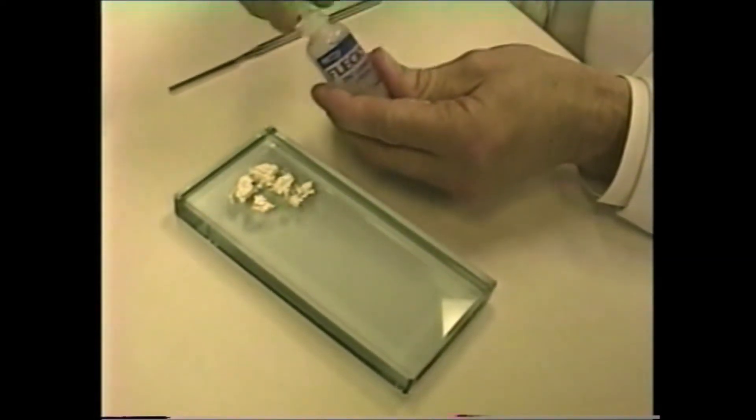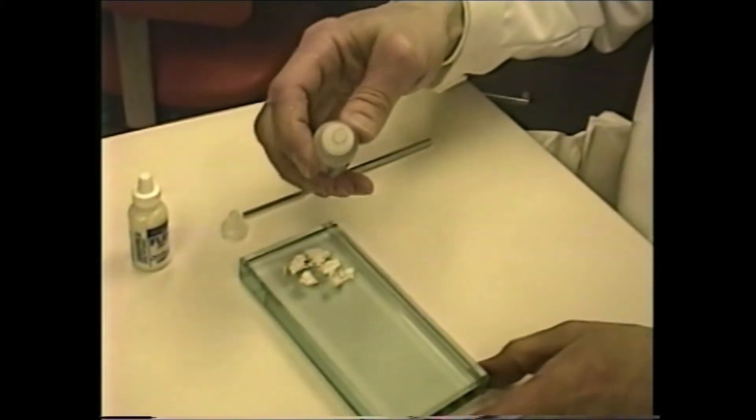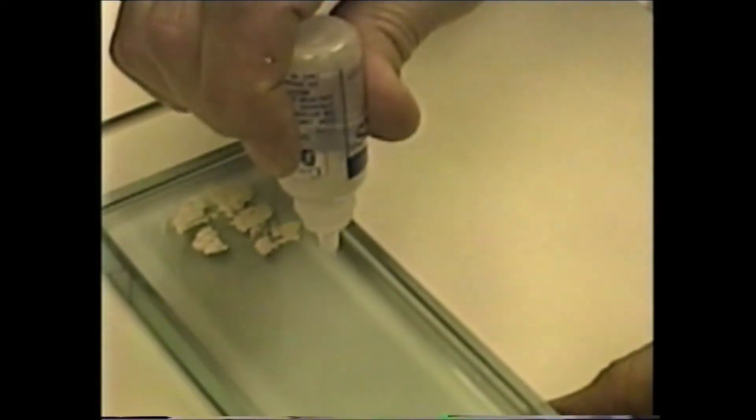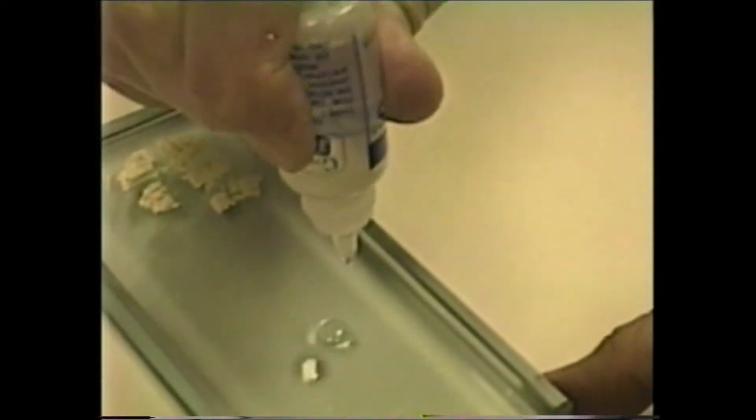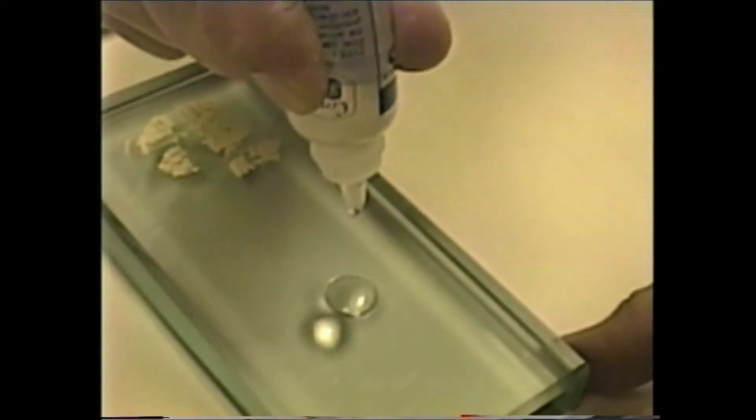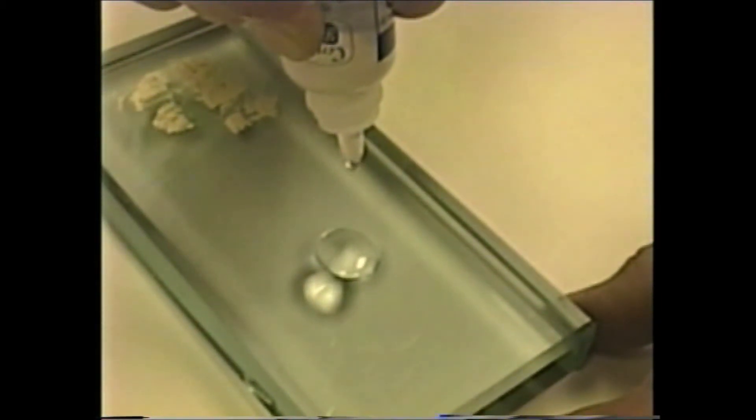Next, I'll dispense the liquid. In dispensing the liquid, you hold the bottle vertically and gently squeeze. You'll see the droplets forming. And you count: one, two, three, four, five, six, seven, eight, nine, ten, eleven, twelve.